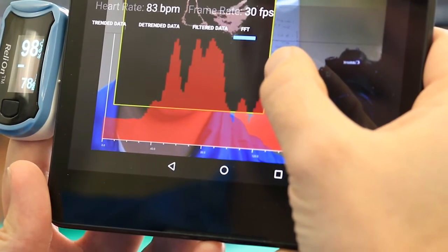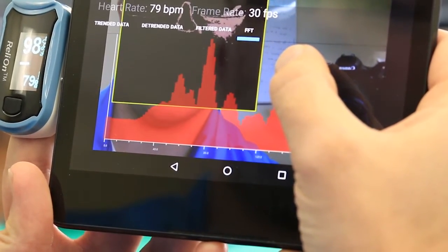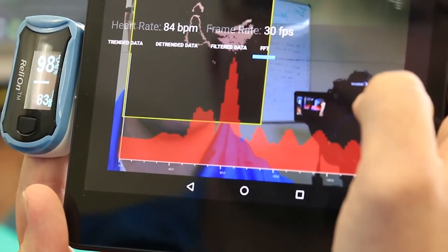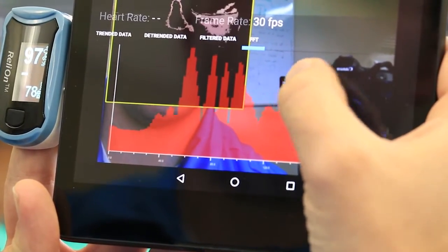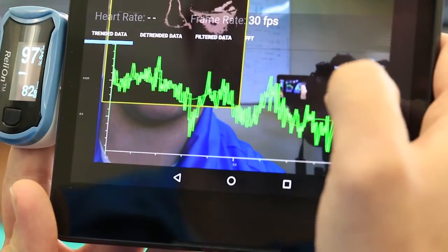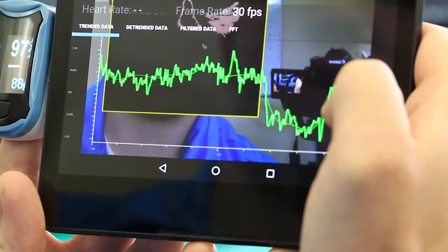There's a pretty high agreement between the pulse oximeter and the application. About 84 beats per minute, mid 80s, start to drop down, lower 80s. You can see other spectral information leaking in that aren't due to heart rate. Again, this is just things due to motion. This is a very tricky problem to solve, and this is one of the ways in which we solve it.